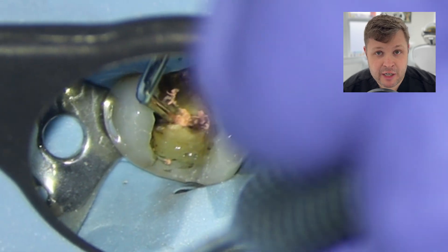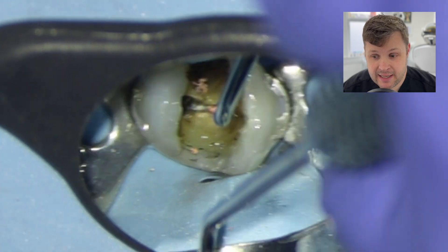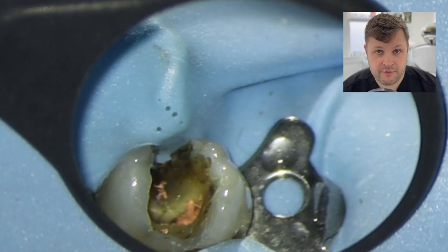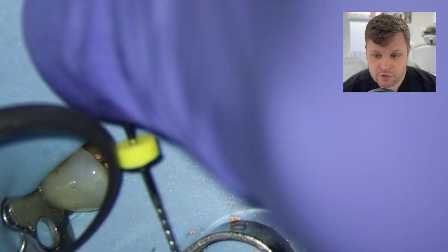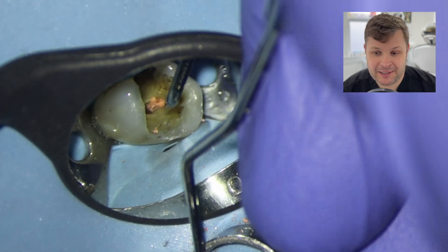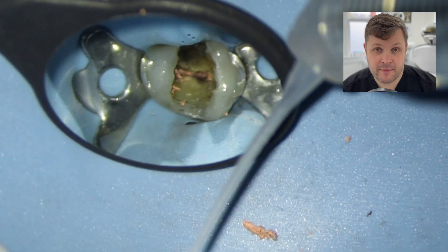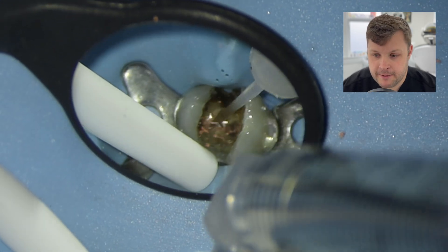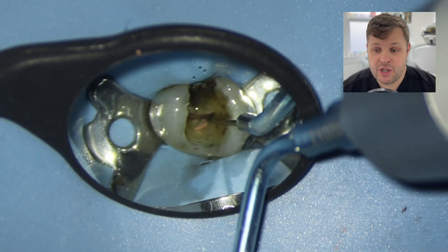There is still a significant amount of GP remaining. I like to take my time — I get a DG endodontic probe and prize the GP away from the canal walls, which dislodges it enough to use the H-file to screw in and pull it all out. You can see this big piece being pulled out here. Remember: when you're screwing instruments in, you're pushing GP into the walls, so lots and lots of irrigant is really important.